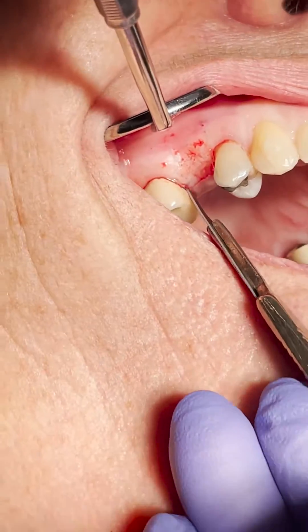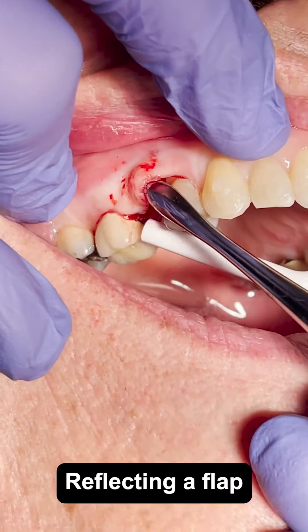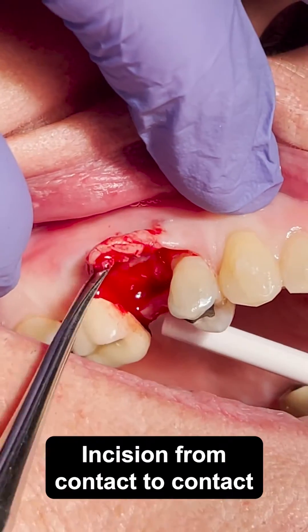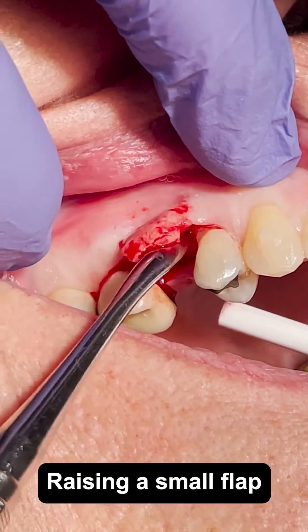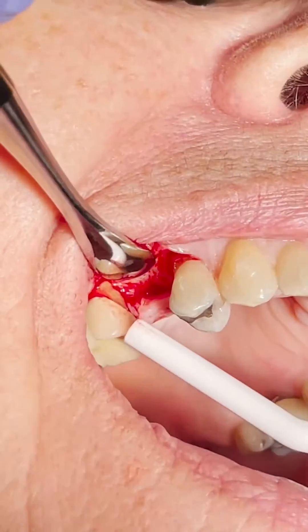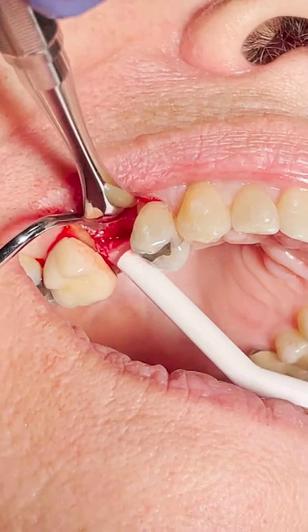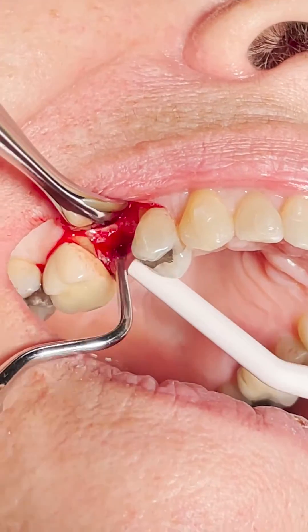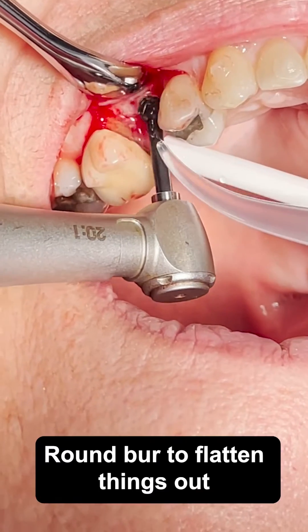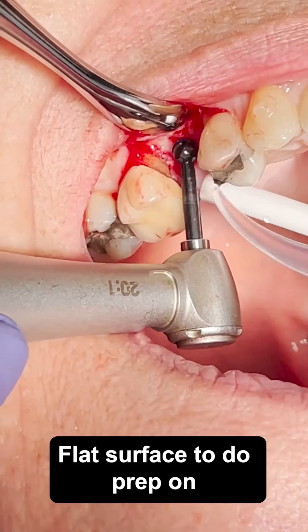I'm going to walk you through this surgery. The first thing I'm doing is reflecting a flap — basically an incision from contact to contact — and raising a small flap in the posterior area. You don't have to worry about papilla sparing back here since it's not aesthetic. I'm using a round burr to flatten things out because the surface was irregular, and I want a flat surface to do my prep on.